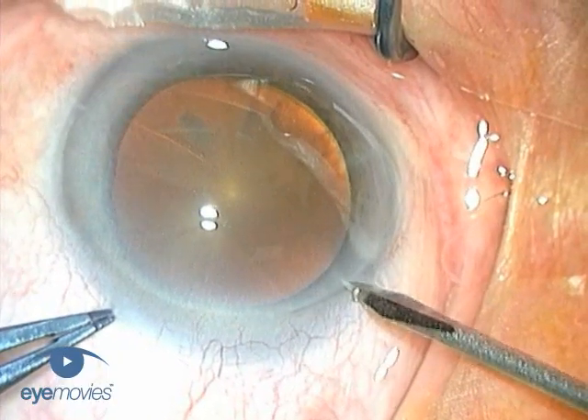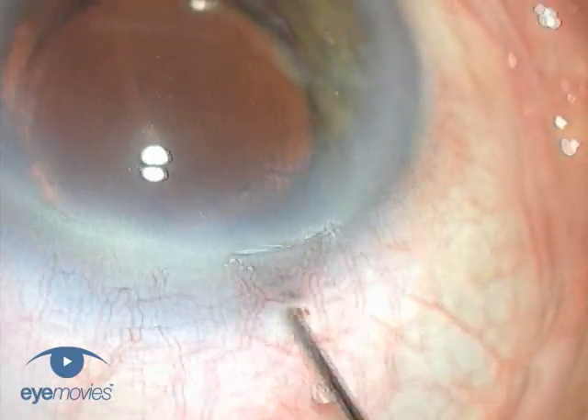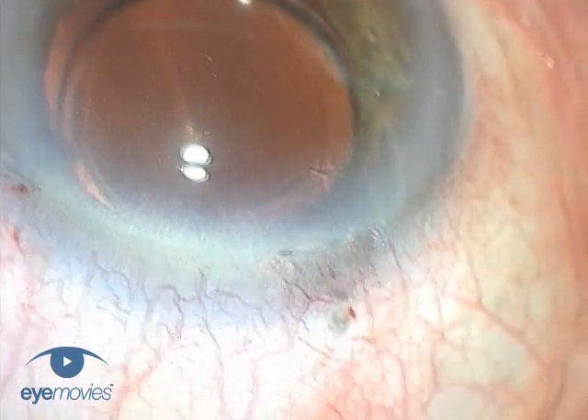As far as the incision is concerned, this consists of its careful construction with accurate architecture so that the wound is reliably watertight. Grooved incisions are particularly reliable at being watertight, and are even stable to pressure applied directly to the posterior lip of the wound.